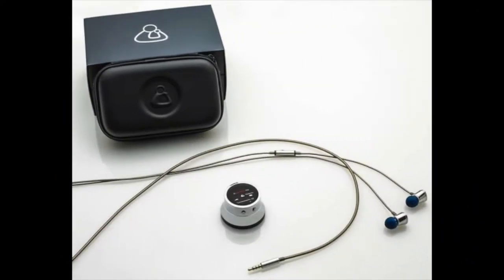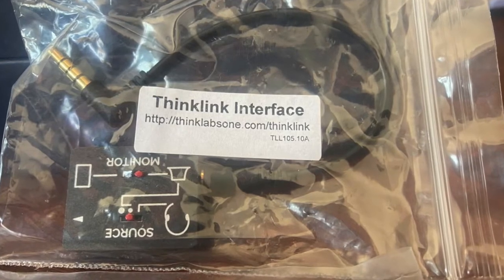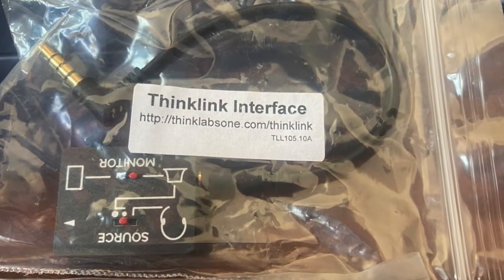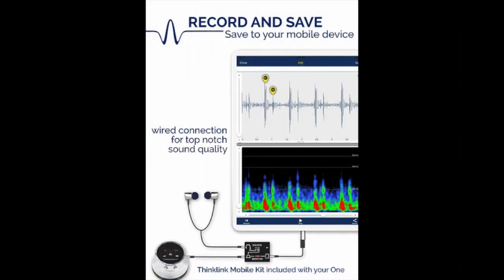This digital stethoscope offers a variety of features and accessories to its users. These include different sizes of silicone tips to fit the earbuds, the ThinkLink mobile kit that allows for direct connection from the stethoscope to your smartphone, tablet, or other mobile devices, and also an app that has the options to record, save, and share the data that has been collected.